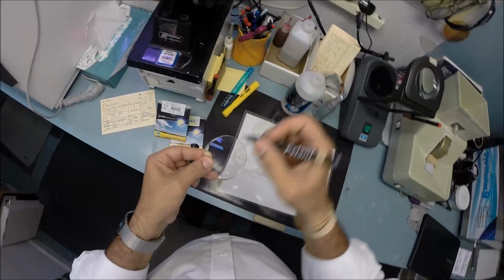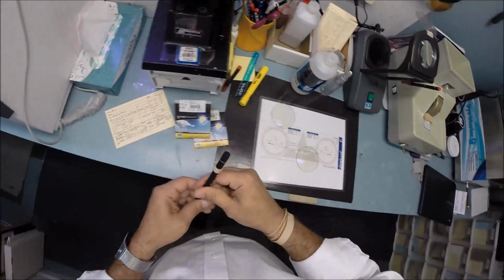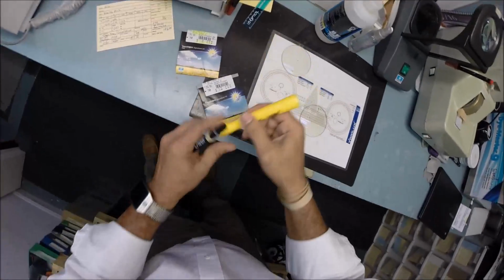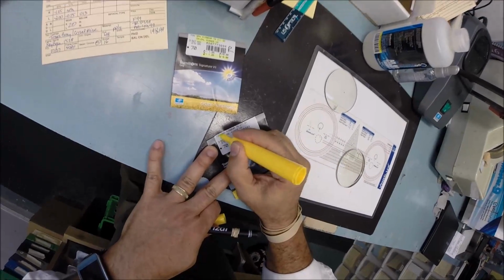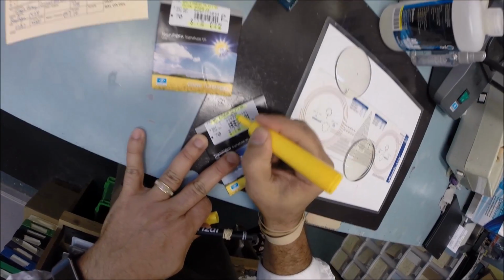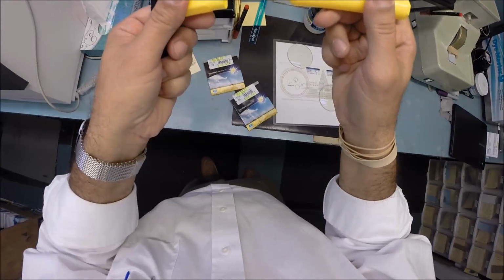Okay, this is going to be the left lens. We'll put an L on there for that. And let's highlight this lens. -2.75, Airwear Transitions 7 gray lenses, Crizal Avance. And if you miss any of that, let me recap.